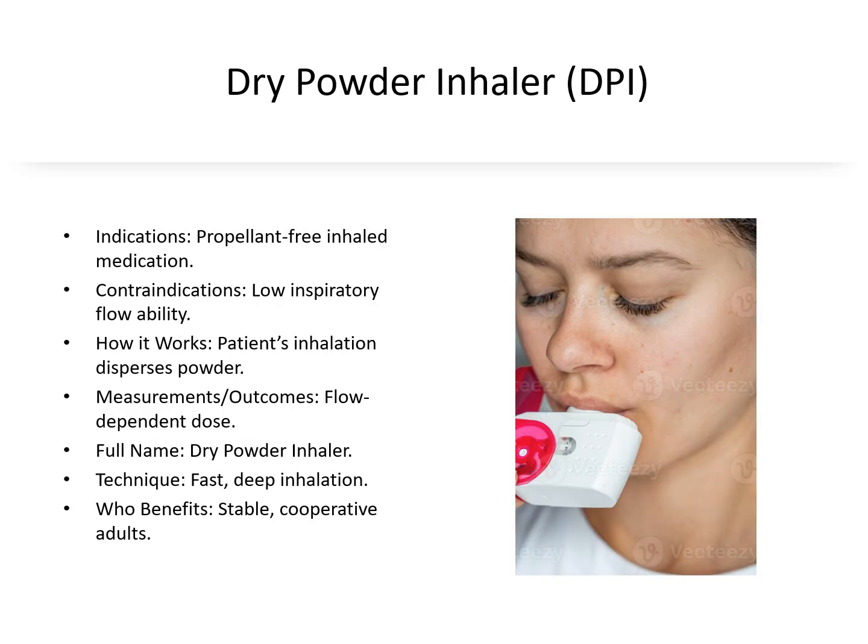A DPI is used to deliver medication without a propellant. It shouldn't be used in patients who have a low inspiratory flow. It works by using the patient's inhalation to disperse the medicated powder. Outcomes are based on inspiratory flow.